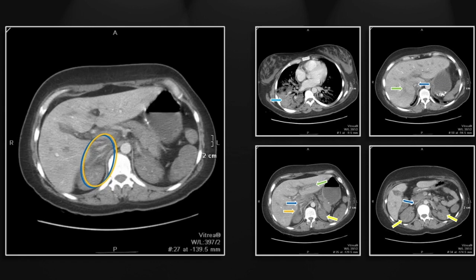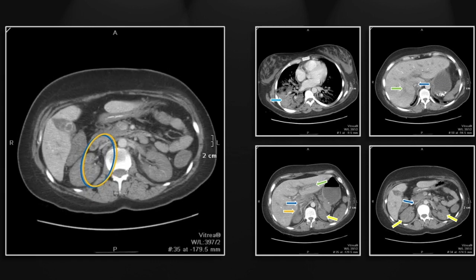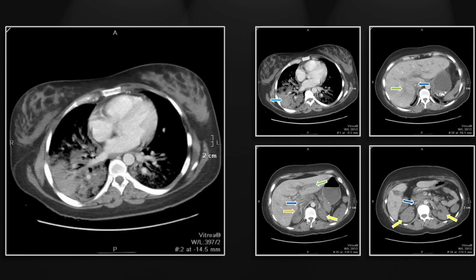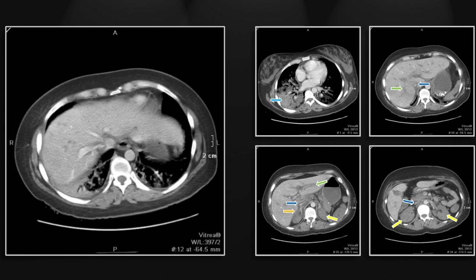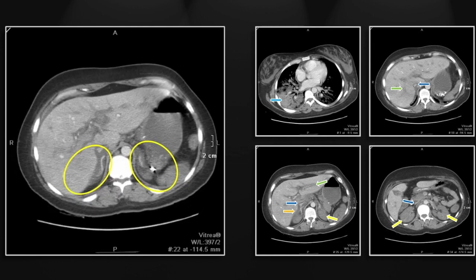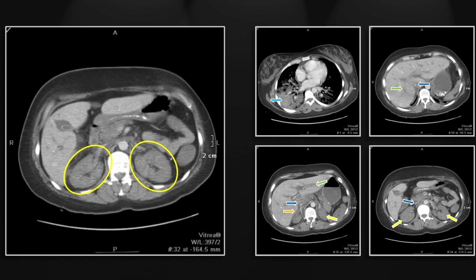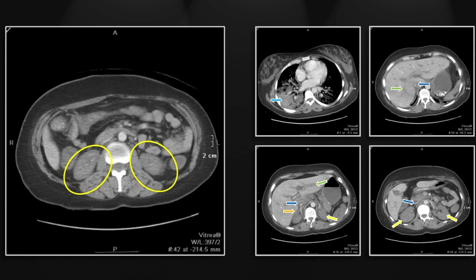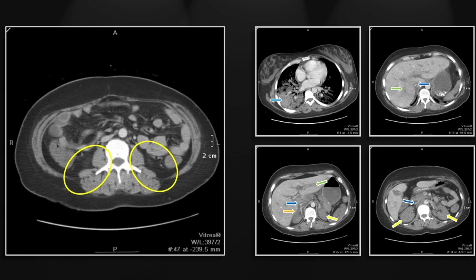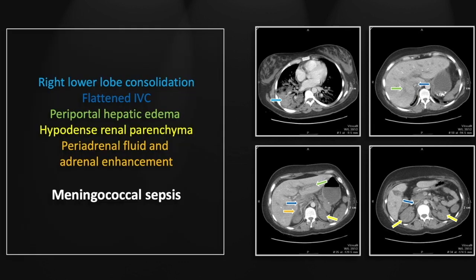There are the adrenals, the flattened IVC, the right lower lobe pneumonia, and the underperfused kidneys — quite striking. This patient was profoundly hypotensive, did have a striking rash, and was accurately diagnosed as meningococcal sepsis, this being essentially the Waterhouse-Friderichsen syndrome.